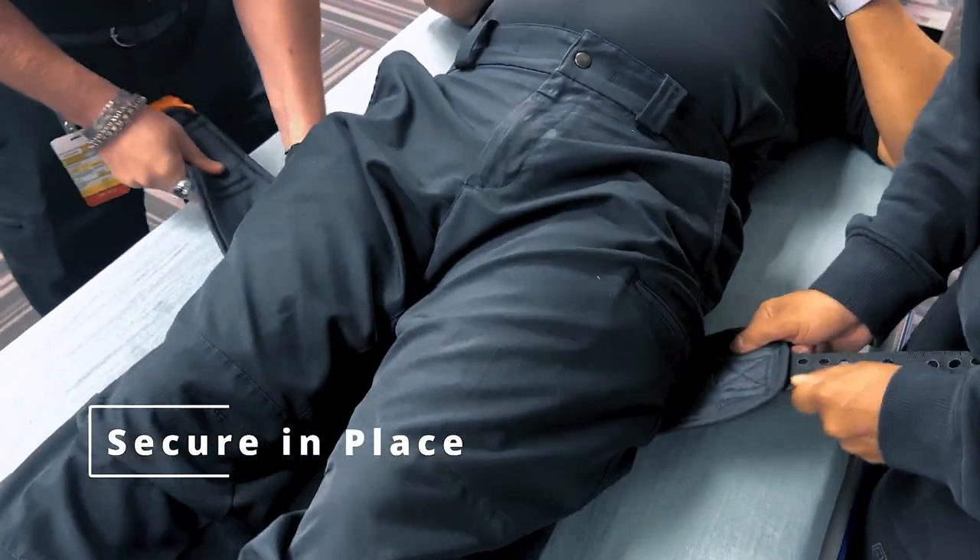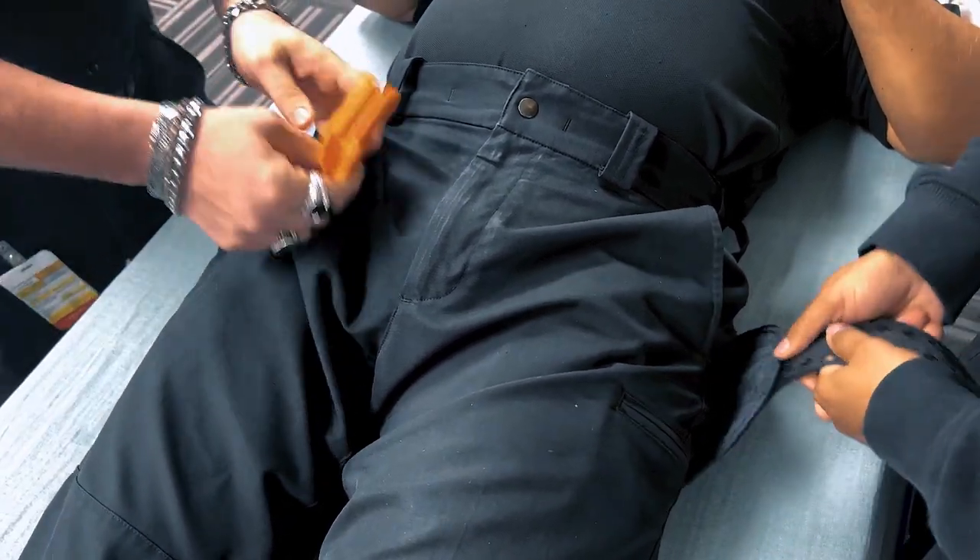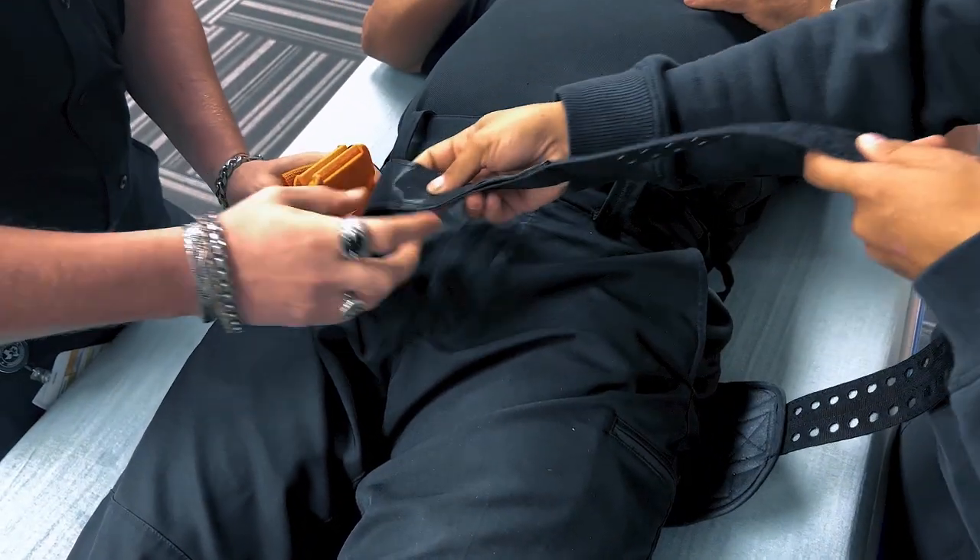Secure the binder in place by fastening the velcro straps or clips. The binder should be snug but not too tight, allowing for expansion of the abdomen during breathing.